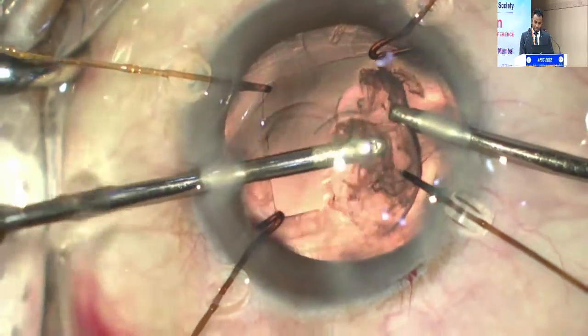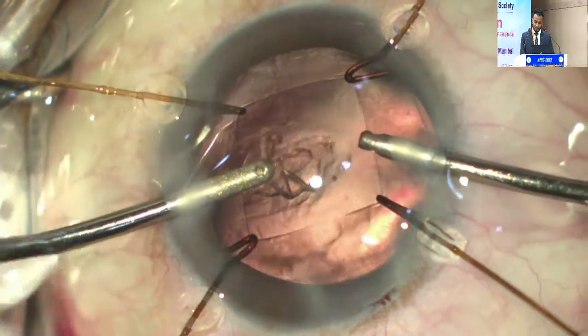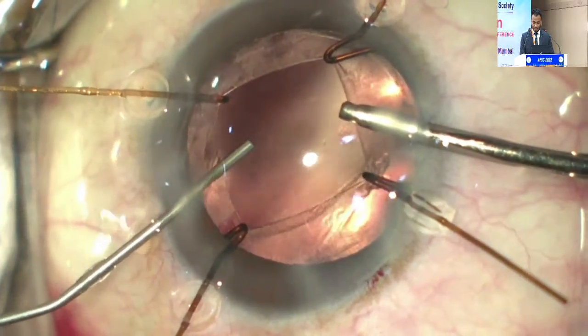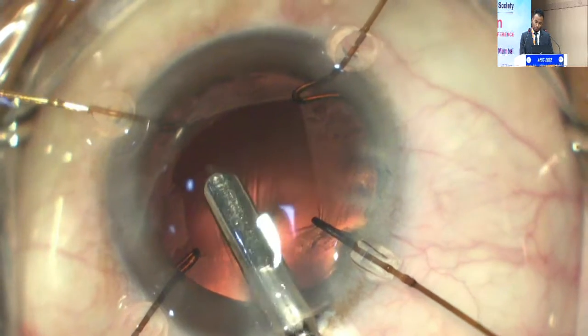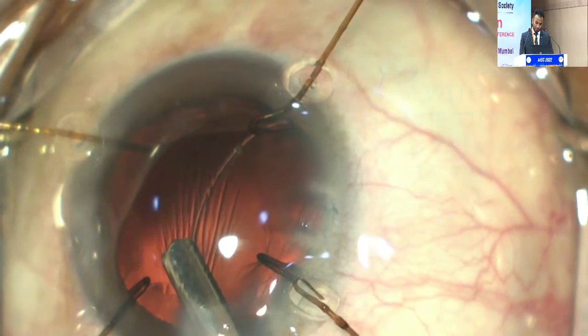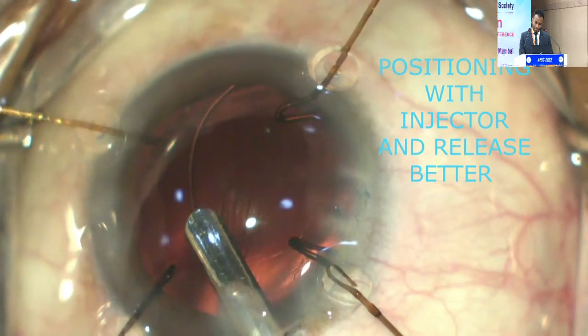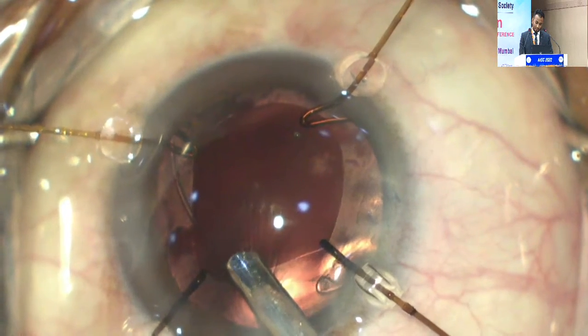Cortical cleanup was done. So in this case I preferred to put a CTR after doing this because the bag was fairly stabilized. I preferred to do it with the injector because you can place the eyelets on the opposite side just by going from the same wound. Otherwise you need to put it through another side port. See, it will come in the opposite and it will stabilize the bag now.